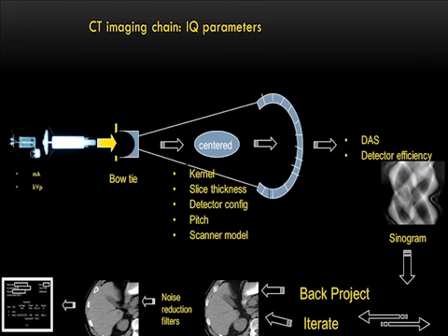I'm sure all of you in this room are aware of the CT imaging chain, and what I will talk about in the next 25 minutes is how we take this sinogram data and reconstruct a 2D image out of it, historically and what we are doing presently.